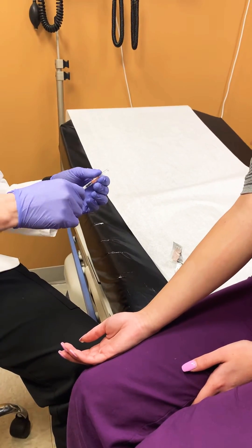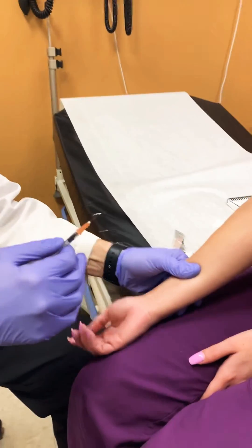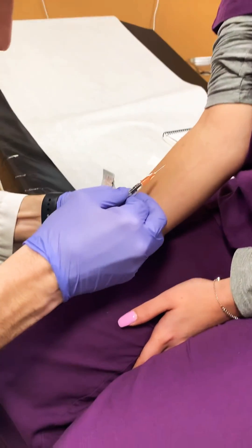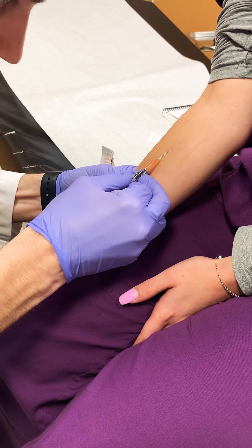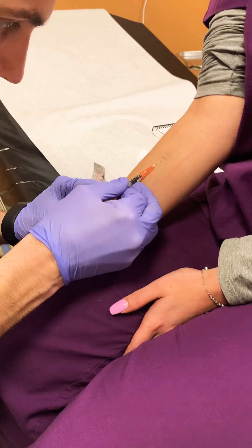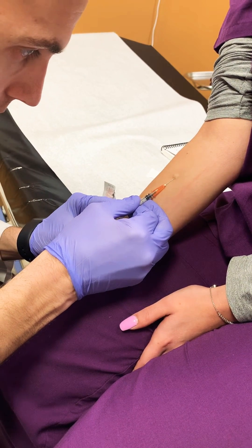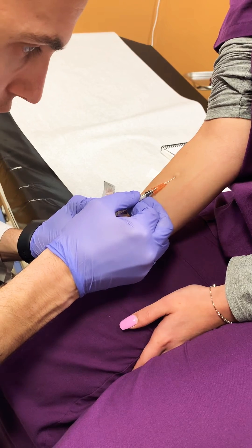When you inject the needle, you want to make sure that your bevel is up. As you can see, I'm creating a wheal by keeping my anchor hand very still and pushing on the plunger.